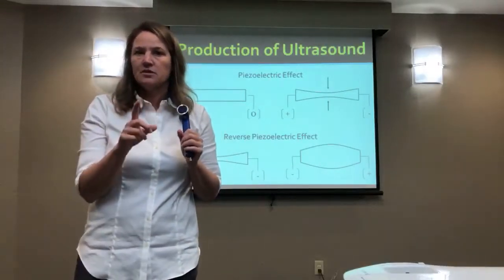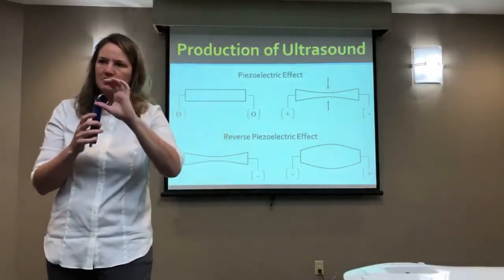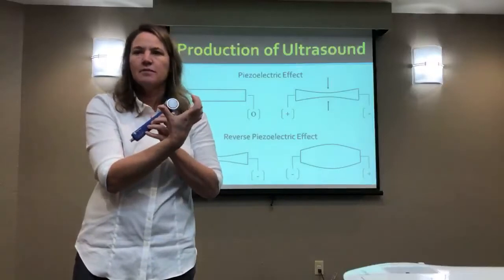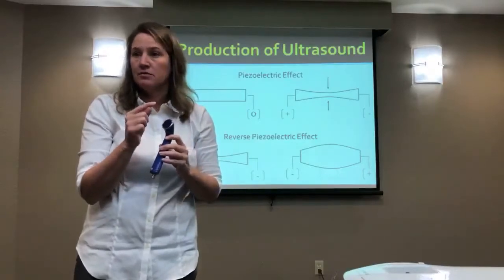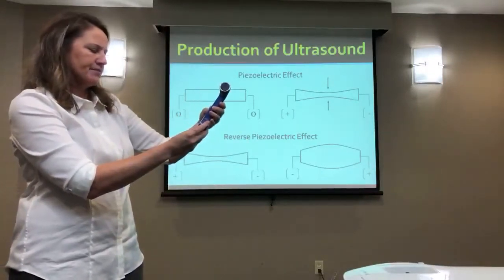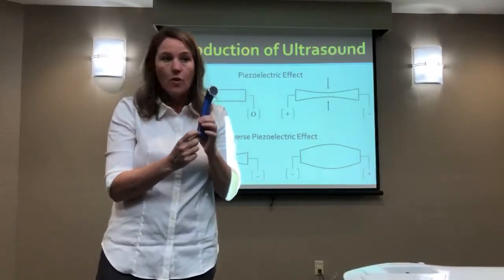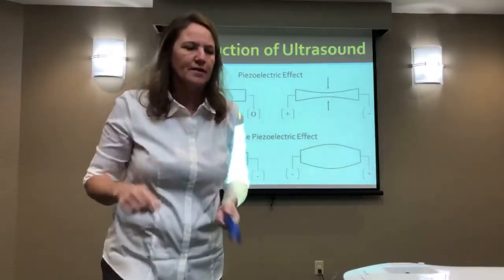Now there was one particular manufacturer. I remember there was a head that kind of, you know the Starship Enterprise? It kind of looked like the end, it was like a pancake at the end of it. So the handle came out, and then it was an enlarged head. And if you looked at the handle, even though the size of the head was probably in the range of 10 to 15 square centimeters, it actually had a 3 square centimeter crystal. So if you looked at it, for example, if I look at this head, it says 5 square centimeters. And if you were to measure, that's approximately how big this is. So if you have a metal housing, you really do need to look and make sure that you know how big your area of treatment is so that you don't treat an area that you're not effective on. So we'll talk about that more in a minute.